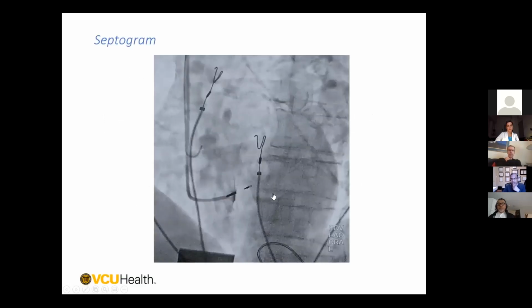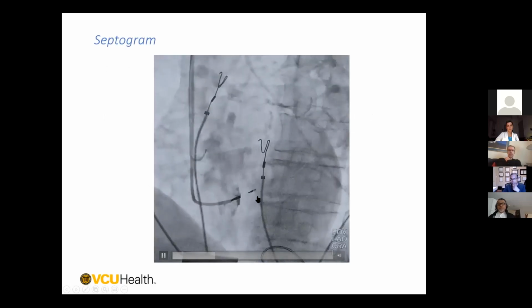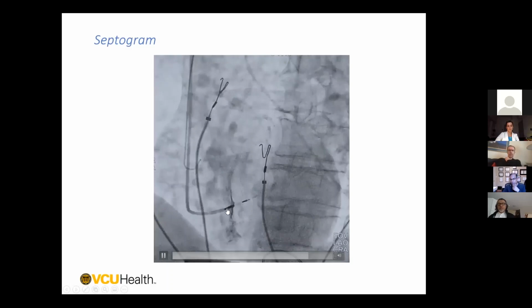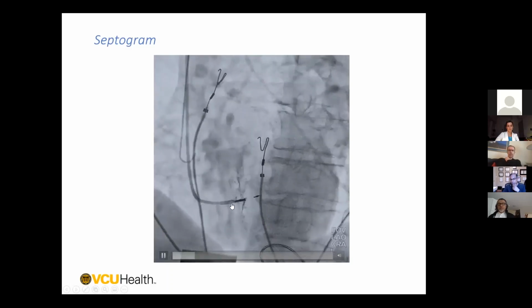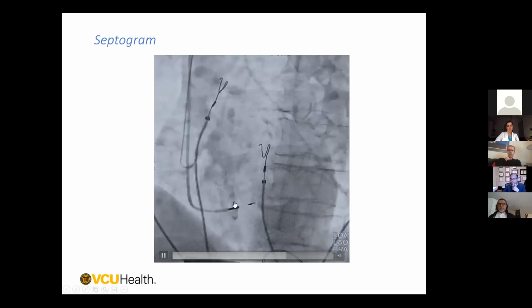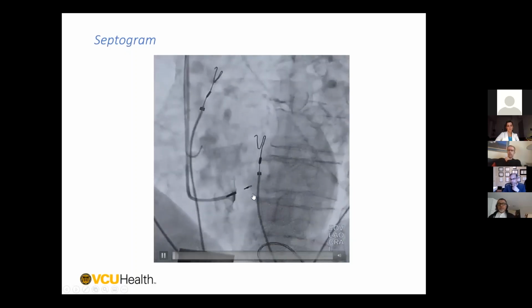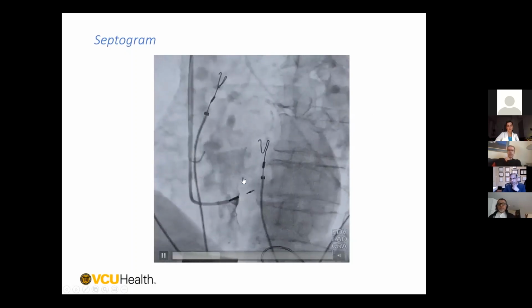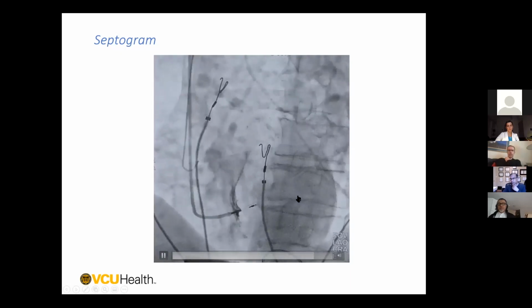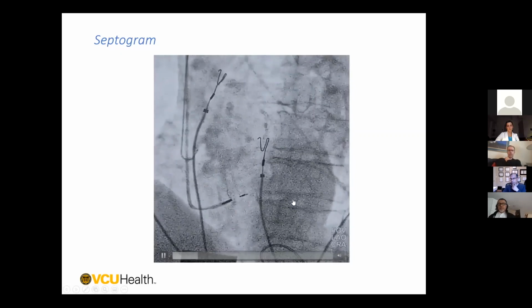So when you add everything up, if you go from the tip of the helix to the proximal end of this proximal electrode, that's about 1.8 centimeters. And so if you know that that's 1.8 centimeters, then in this case, here we have an LAO 30. You can see the lead is pointing towards the spine, so clearly he's septal.